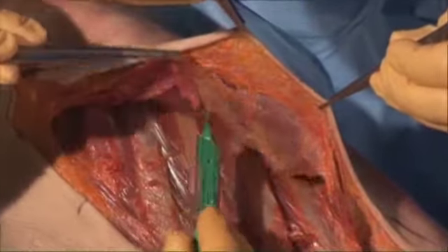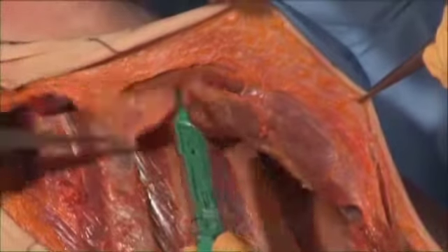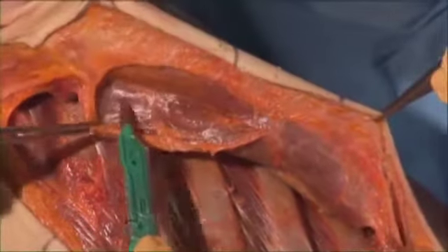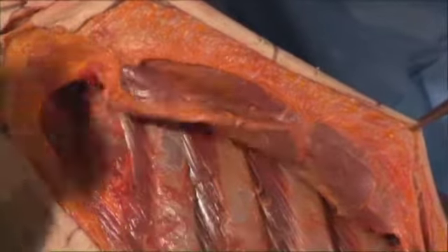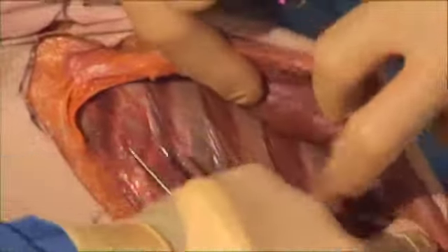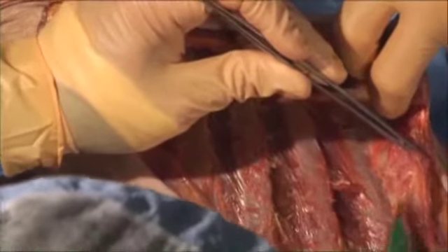So you've lifted the serratus and the latissimus up, so now you're under the whole serratus and latissimus, and the neurovascular bundles will be situated between the latissimus and the serratus down through this interval here, which you don't even need to go into. So now once you've elevated that, then you've protected the bundles, the long thoracic and the thoracodorsal. And you keep working inferiorly.